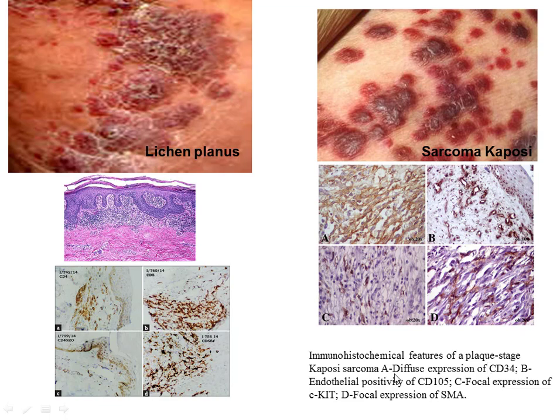Here you can see diffuse expression of CD34, endothelial positivity in CD105, focal expression of c-KIT, and focal expression of smooth muscle actin.